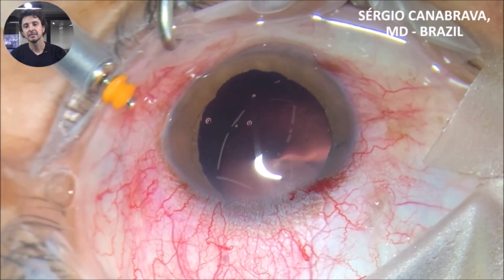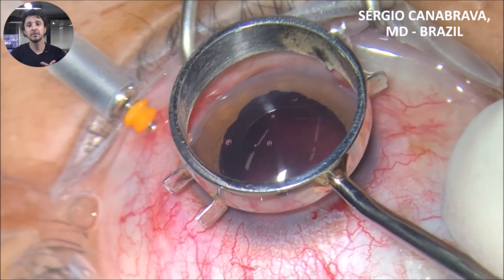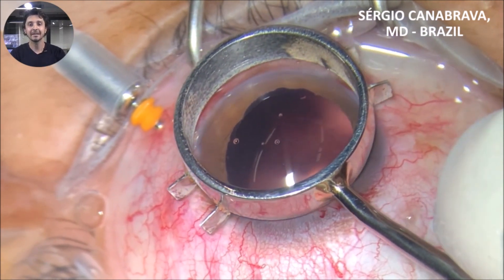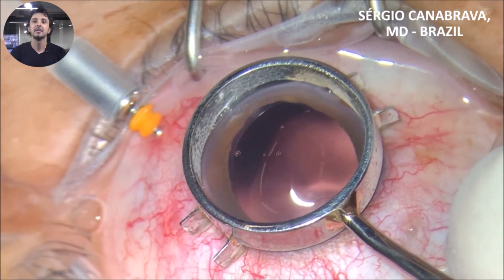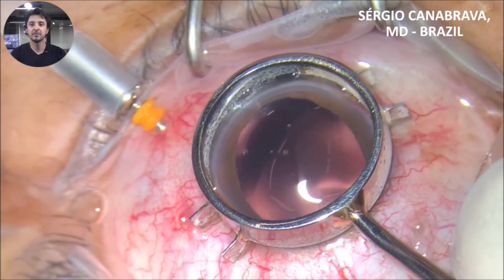Tip 3: mark two millimeters from the limbus at the slit lamp, or you can use the four-flange mark, where you can see two millimeters from the limbus and use the needle to mark it and insert it, as you can see in this video.